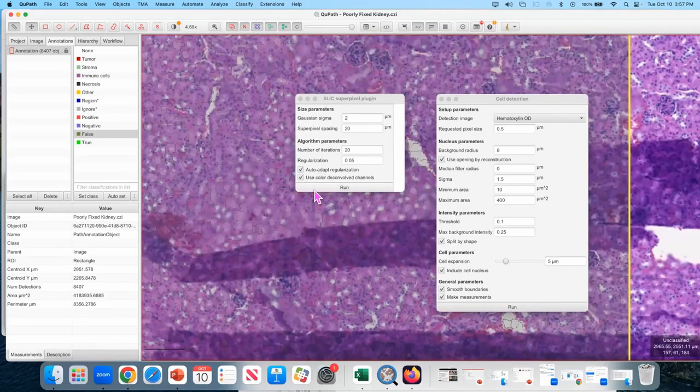Okay, so real quick, superpixel spacing will basically put one tile every approximately 20 microns, it's not exact. Before doing it, it applies a Gaussian sigma of 2 to just smooth out the nuclei. I'm not trying to be at that level of detail. Regularization is how square the superpixels are going to look. If you set that to 1, you will get square or incredibly close to perfectly cornered superpixels.